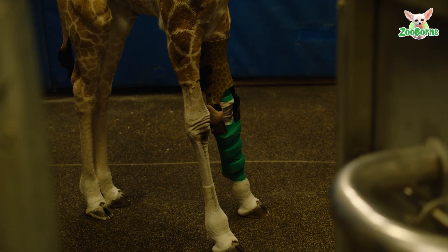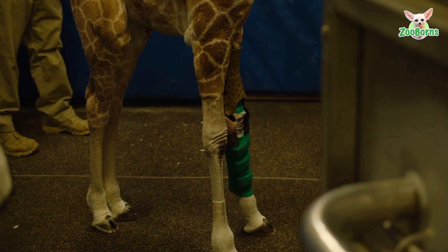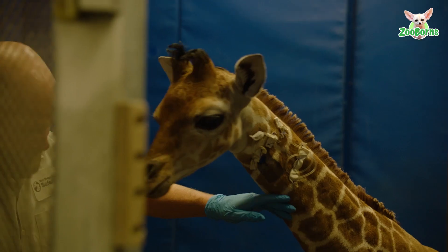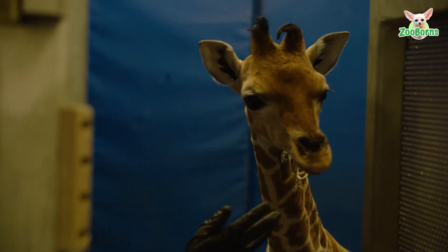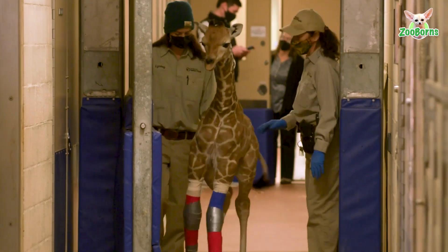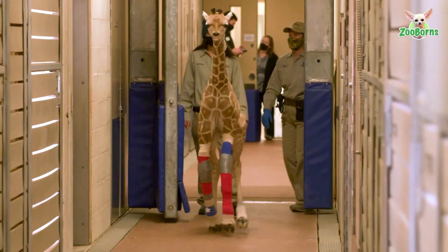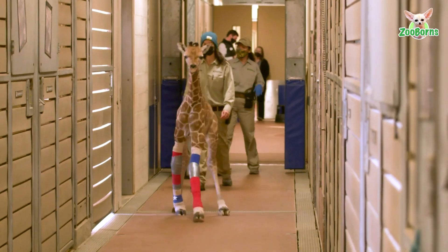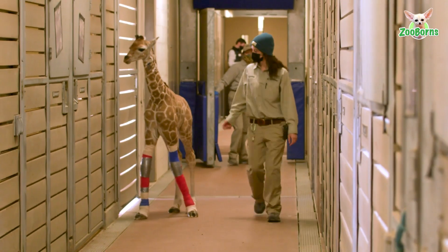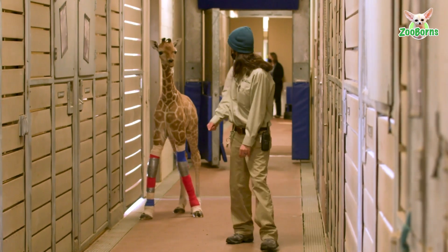The medical concern we're dealing with with this giraffe is pretty uncommon. We often see laxity within joints, and most of the time it's the joints further down, closer to the hooves. The carpal joint — what looks like her knee on her forelimbs — it's a little unusual to see hyperextension in that area. This is the first carpal joint hyperextension that I've worked on with a giraffe, and to see it in both limbs was pretty concerning.